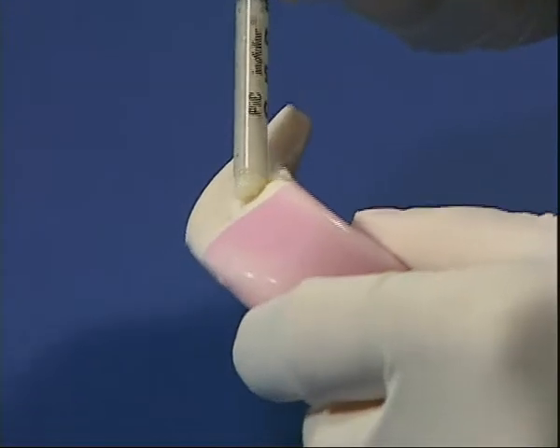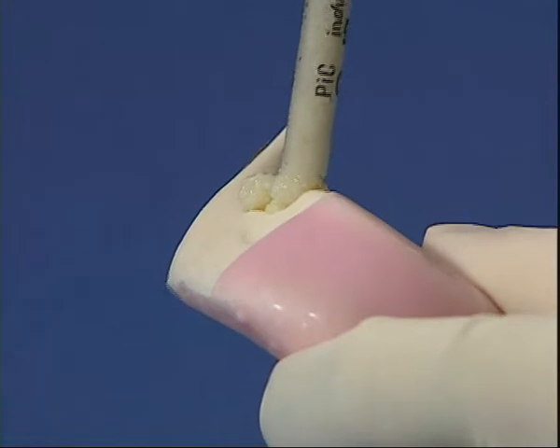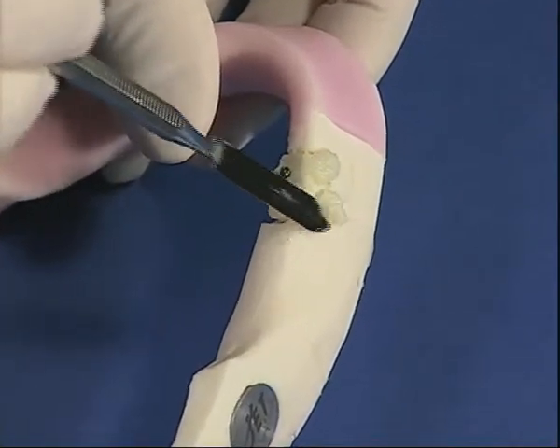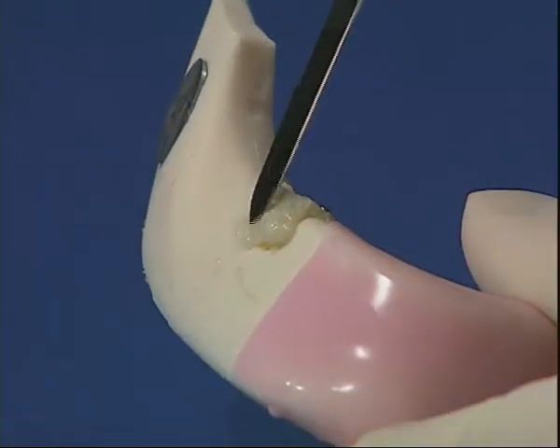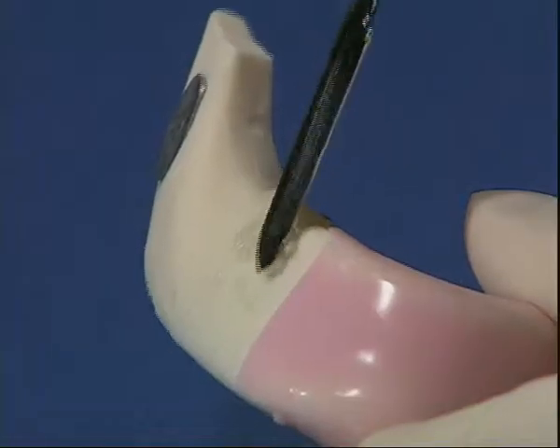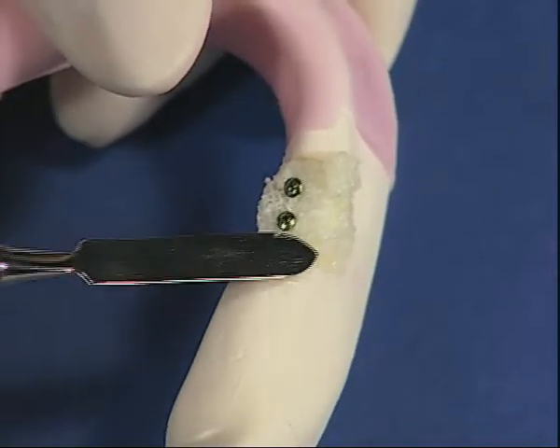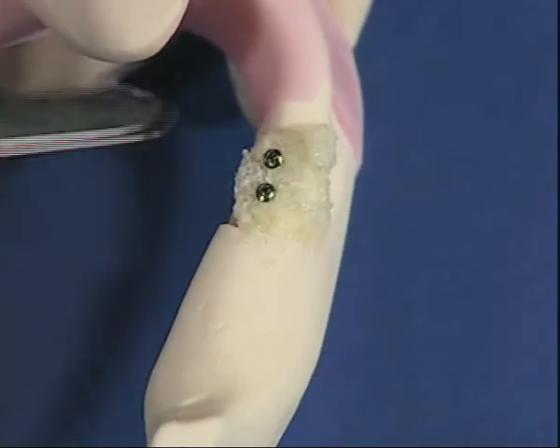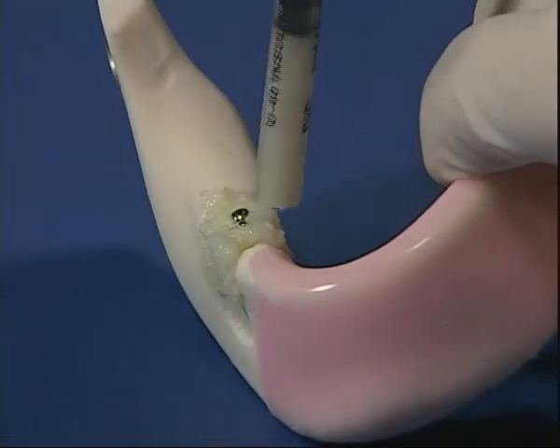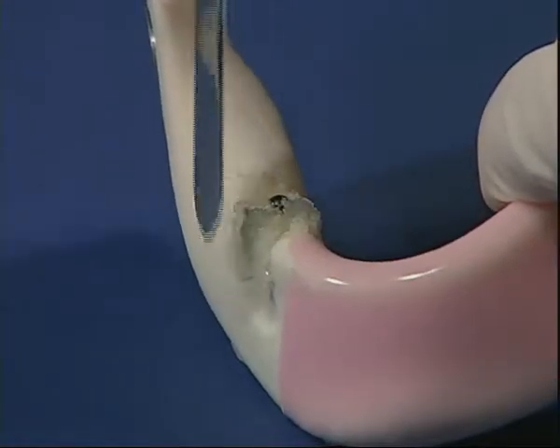Let's apply BioGen mixed gel. As you can see, the bone tissue provides easier handling, important plasticity, which allows the surgeon to work safely without the risk of invading the areas in front of the bone cavity. Adapt the material. Slightly press without compressing it too much. You must leave a little space within the material so as to allow the blood vessels to form. It is, nevertheless, important not to leave large empty spaces as the vessels will not form.